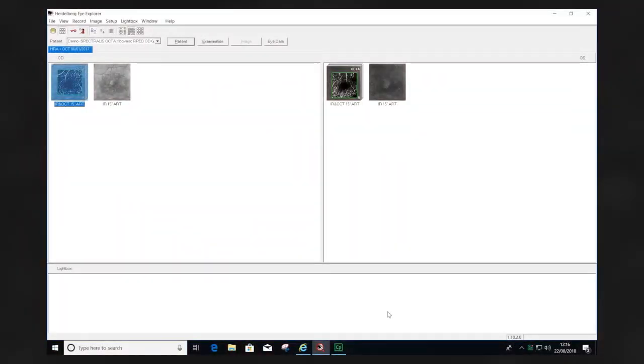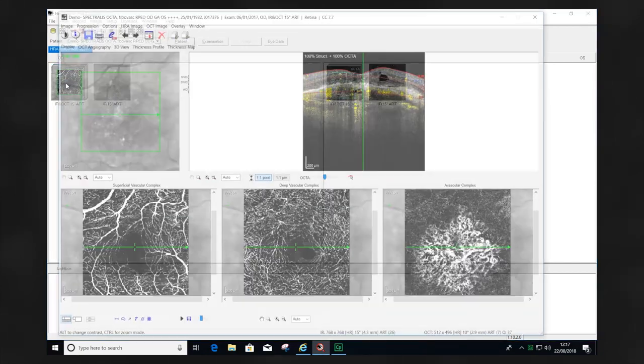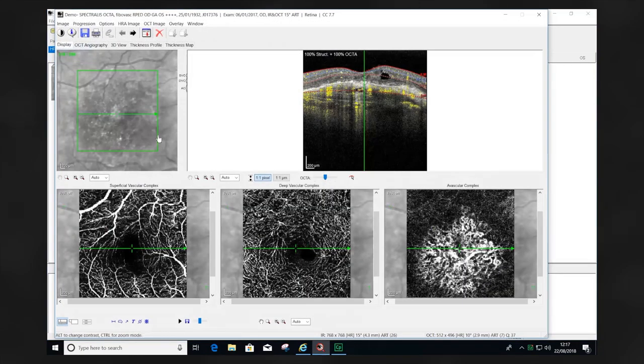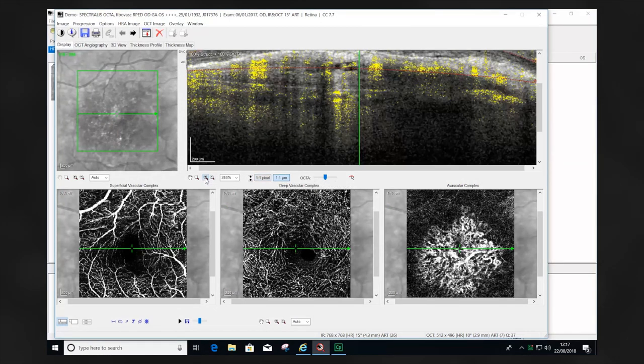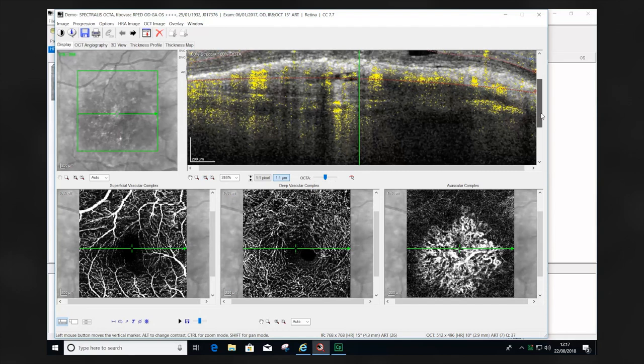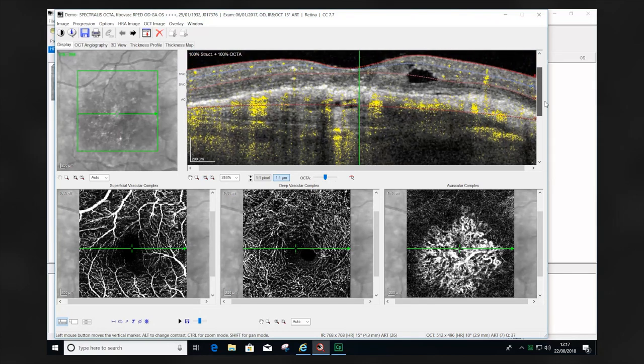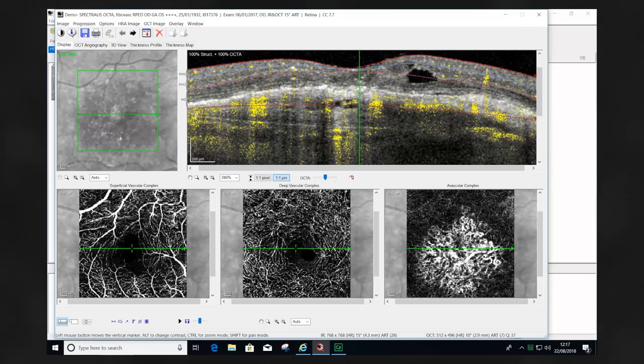Segmentation errors occur frequently within OCTA scans and these must be corrected prior to reviewing the images. If we look at this example of a patient with a fibrovascular PED, we can see that the Bruch's membrane position on the automatic segmentation has been incorrectly defined. This needs to be corrected if we're going to see proper visualization of the choroidal neovascularization.